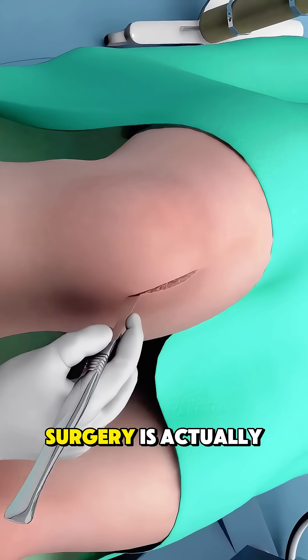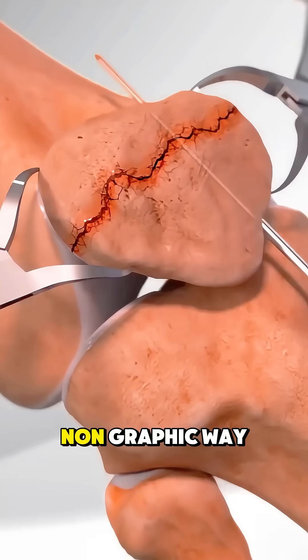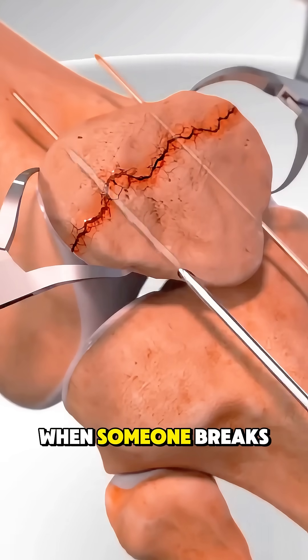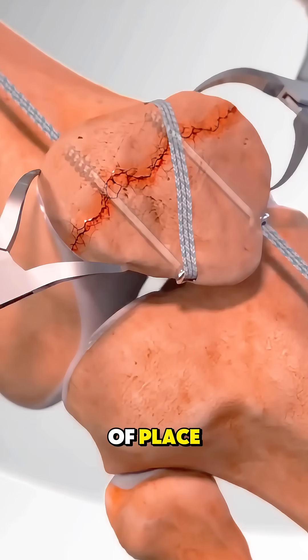Ever wonder how patella fracture surgery is actually done? Let's break it down in a simple, non-graphic way. When someone breaks their kneecap, surgery is often needed if the bone pieces are out of place.